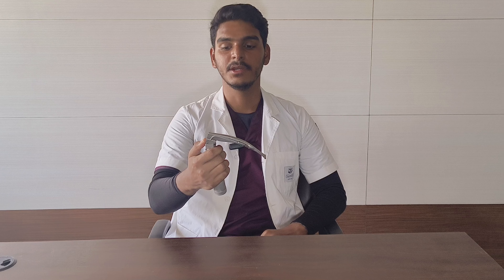Now I am going to mention some general points related to the laryngoscope. As I said earlier, the laryngoscope has two types of blades. One is the curved blade — as you can see, the blade is curved and not straight. This curved blade is called the Macintosh blade. And there is one more laryngoscope where the blade is straight instead of curved — that second category is called Miller's blade.